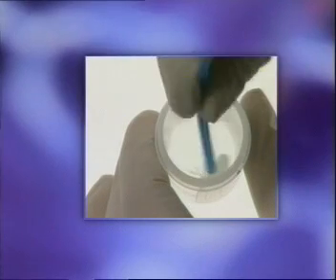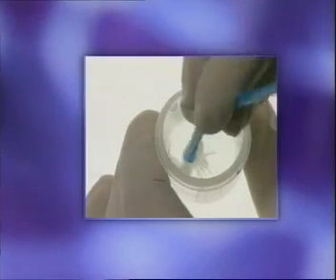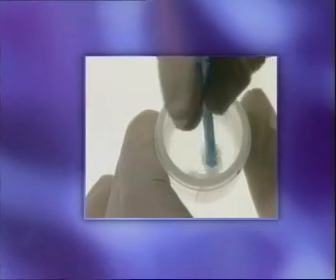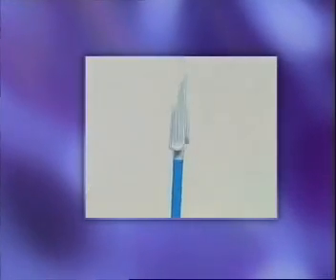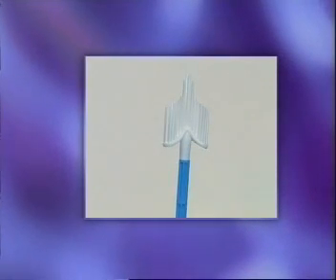Immediately rinse the sample off the broom in the PreserveSite solution vial by pushing the broom against the bottom of the vial ten times, forcing the bristles to bend apart. Next, swirl the device between the thumb and the forefinger vigorously to further release cervical material. As a final step, inspect the device to ensure that no material remains attached. The broom may now be discarded.